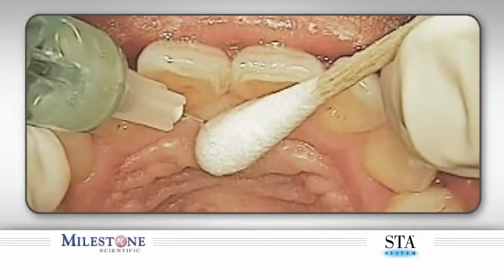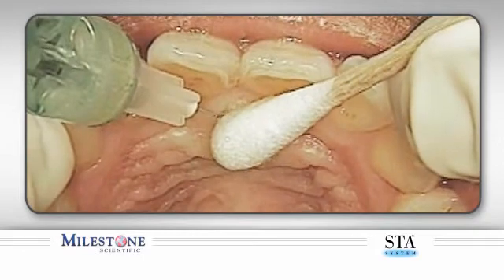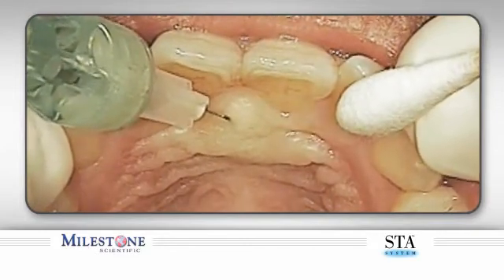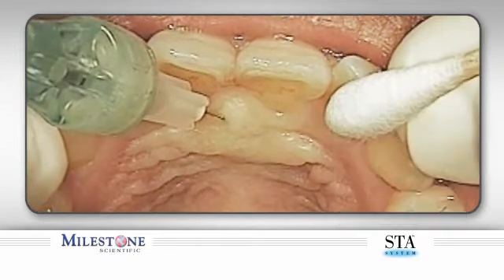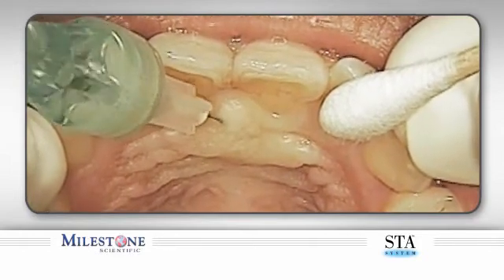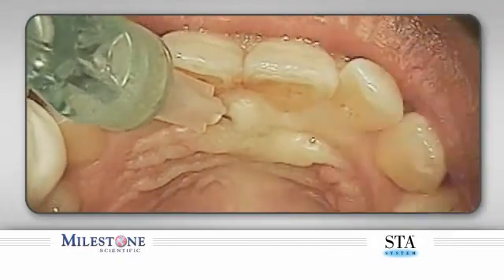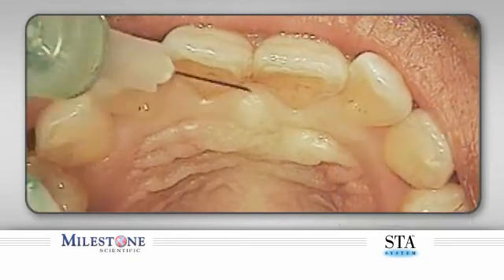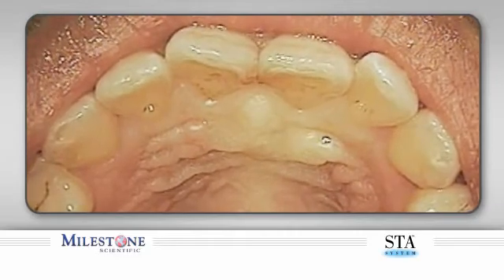Advance the needle within the incisive canal five to eight millimeters. All movements must be performed very slowly and gently. Do not move the needle more than one to two millimeters forward each time. Rapid movements are contraindicated. When the needle is in the canal and contacting the inner bony wall, stop movement and aspirate by depressing and releasing the foot control pedal. Do not exceed three quarters of the needle length penetration into the canal. If aspiration is negative, maintain position and deliver the proper amount of anesthetic. As the anesthetic solution is delivered, you will notice distinct blanching of the tissue. To avoid anesthetic spray back during needle removal, while the needle is still embedded in the patient's tissue, depress and release the foot control pedal. Count three beeps after releasing the foot control and then totally remove the needle from within the patient's mouth. Direct the needle away from the patient as a small amount of anesthetic solution may still be present.